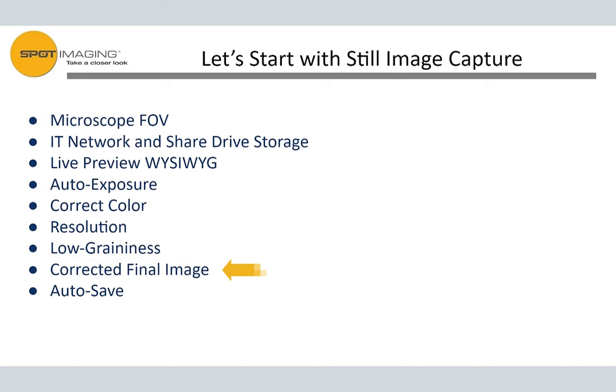And so what happens is that you can actually set up what are called flat fields that automatically correct the image and will smooth that out electronically. So we actually look forward to using those things. And then finally, when we talked about everything, it's the auto save function again.